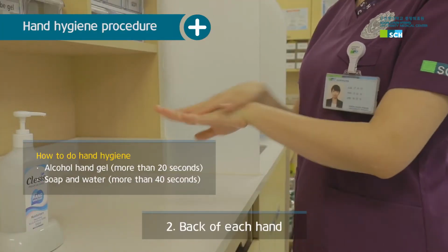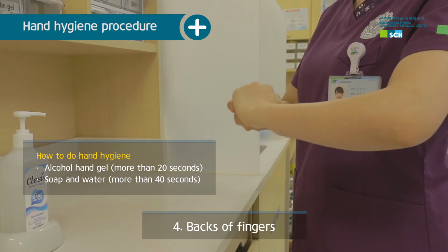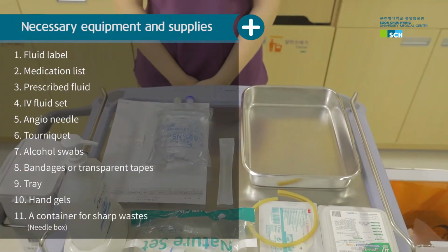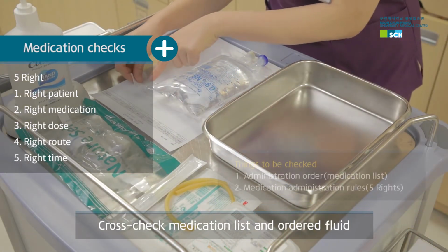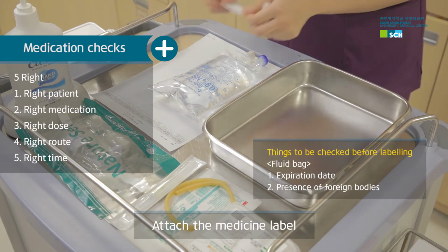Before preparing equipment, perform hand hygiene with hand sanitizer for at least 20 seconds until your hands are completely dry. Prepare necessary equipment and supplies. Check the medication list and the medicine label accurately and attach the medicine label to the fluid.